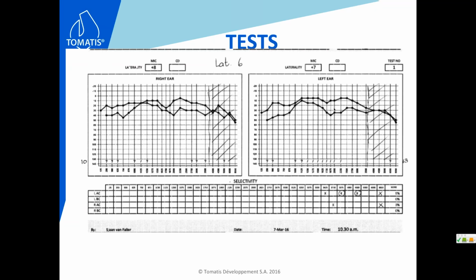The selectivity is closed in the left ear from 3,625 and in the right ear from 3,750.